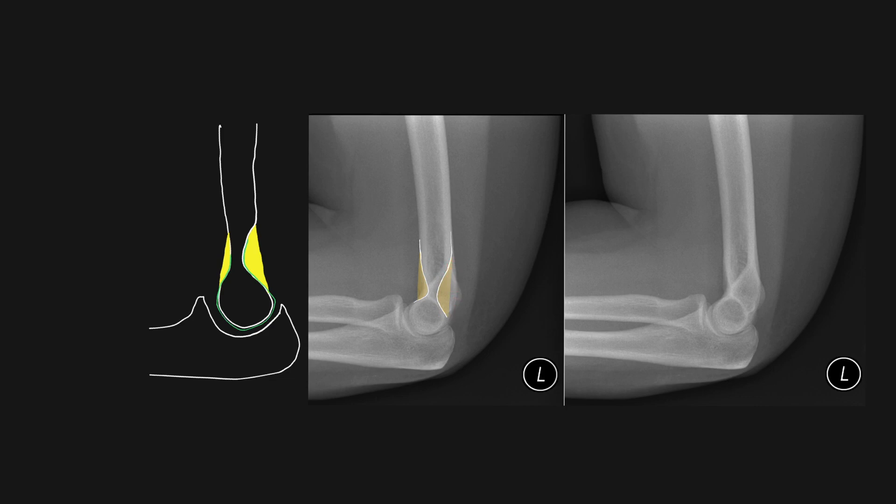Unlike the anterior fat pad, which is seen here — although there's less fat anteriorly, because this fossa is more shallow, the fat can actually be seen as this lucent line in front of the anterior cortex of the distal humerus. Note that the fat pad posteriorly is never seen in normal individuals on a radiograph.